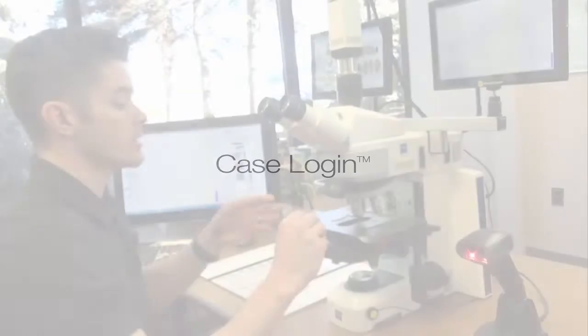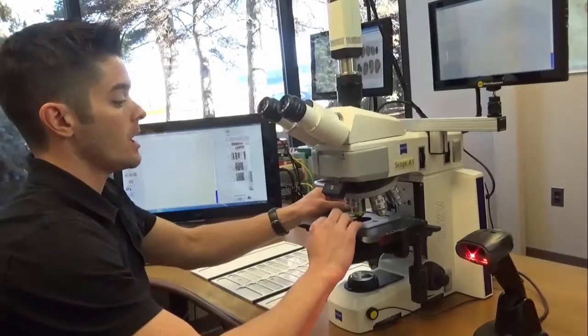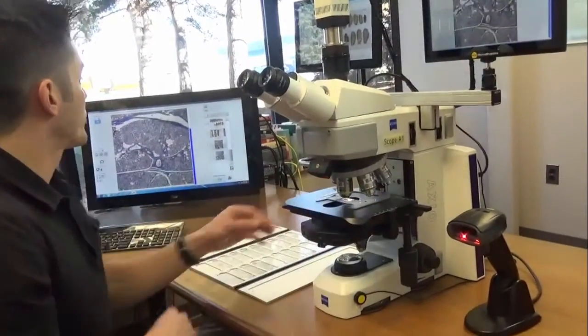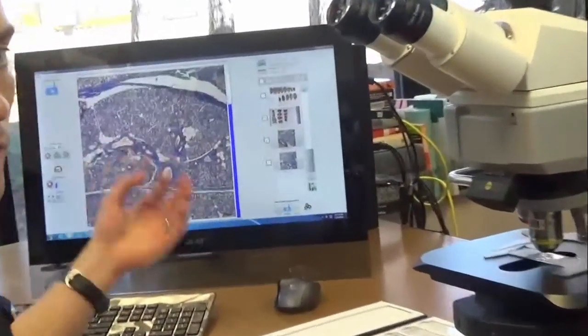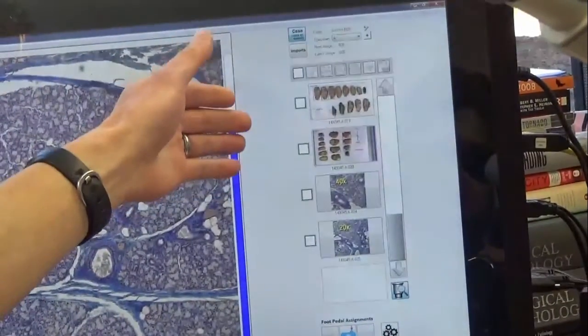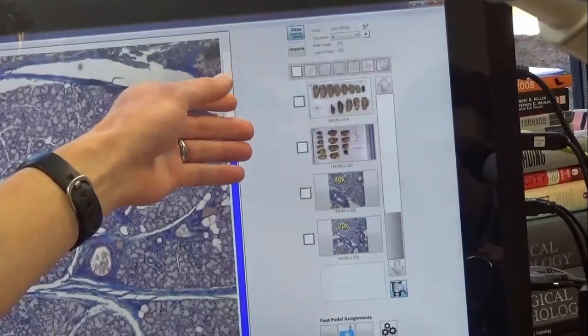Case login is achieved by simply scanning the slide with our Case Tender here, and this automatically brings up any previous images you may have, including gross images, and populates them into our film strip.